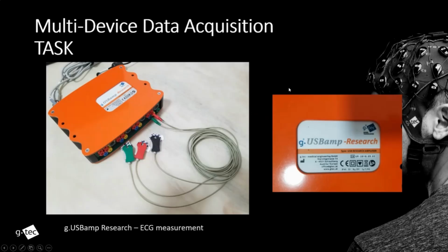One more thing to mention is today we're measuring ECG. I've already connected the 3 electrodes on my body now. So we'll measure the ECG data later on through the USB amp.